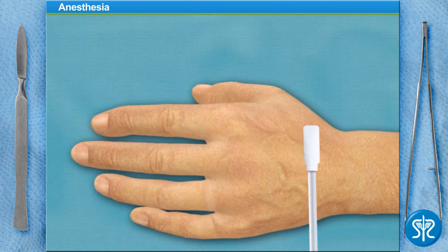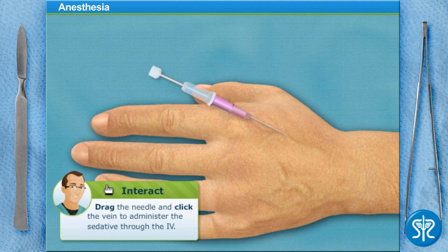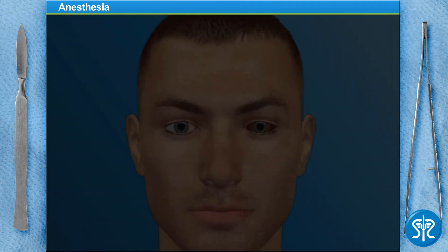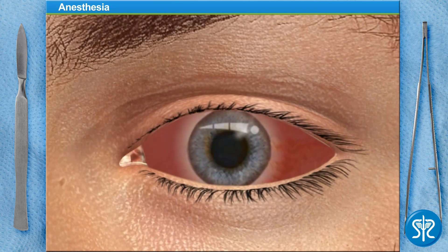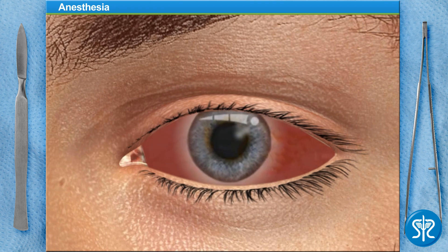First, we need to administer a relaxing sedative intravenously. This will make our patient drowsy, but not put him to sleep. Just prior to surgery, additional drops of anesthetic are applied. We'll use a device called a speculum to hold the eye open wide during the procedure.